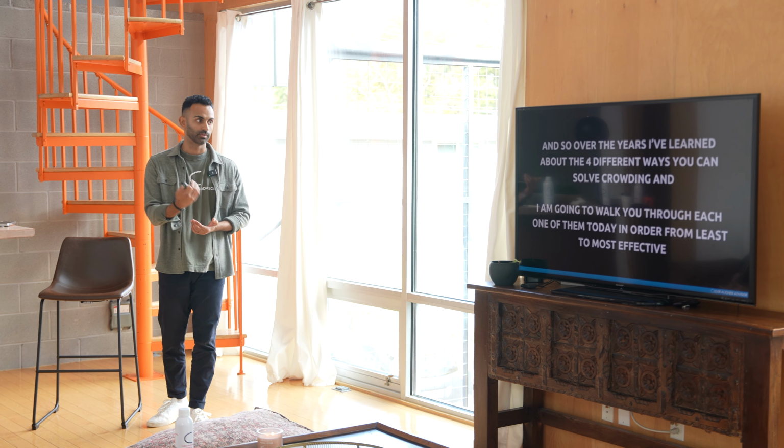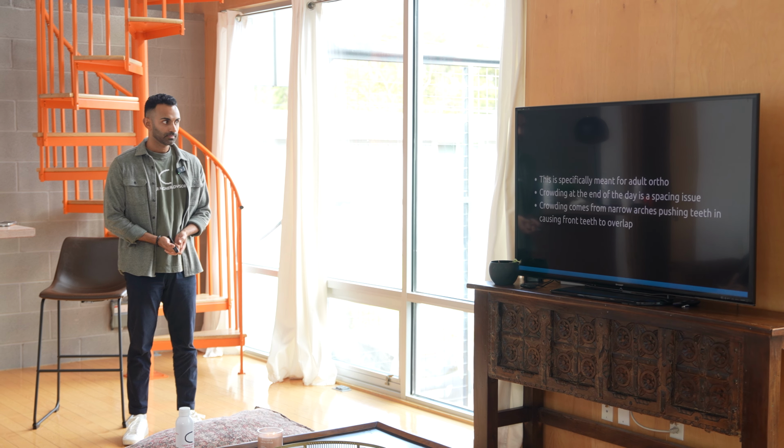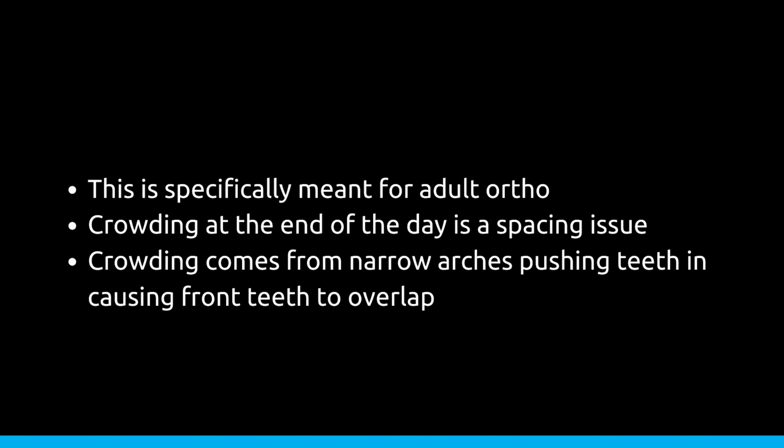So why does crowding happen in the first place? This is, again, like I said earlier, it's meant for adult ortho, but crowding at the end of the day is a spacing issue, right? We have usually narrow arches that are pushing the teeth together, and that's what causes the overlap in the front, because there's just not enough space.